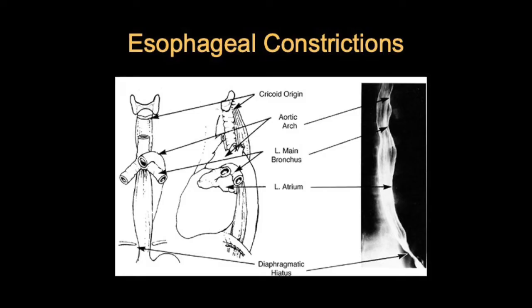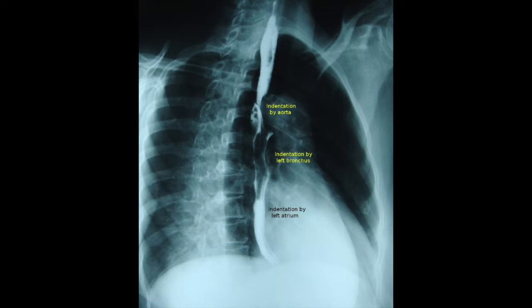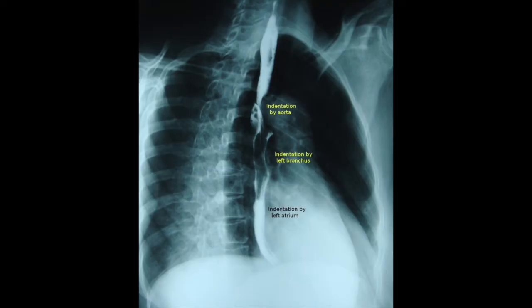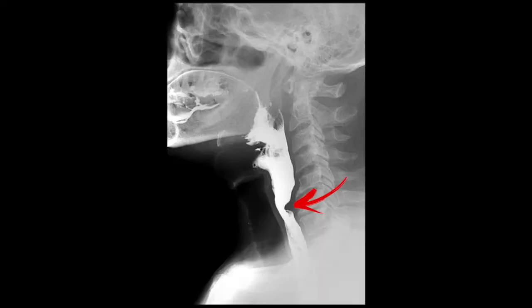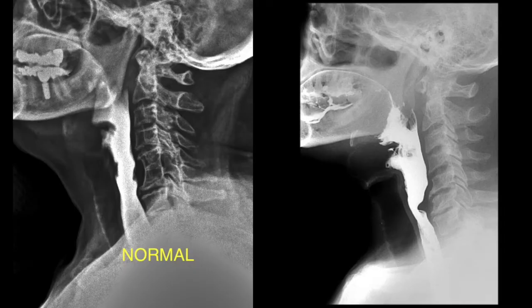Before examining barium swallow images, we should know about normal esophageal constrictions. There are three anterior indentations: from the aortic arch, the left main bronchus, and the left atrium. These are normal and not to be confused with extrinsic mass lesions. There is also the cricopharyngeal bar at C6, a posterior indentation that can appear with motility disorders or even as a normal prominent cricopharyngeus.